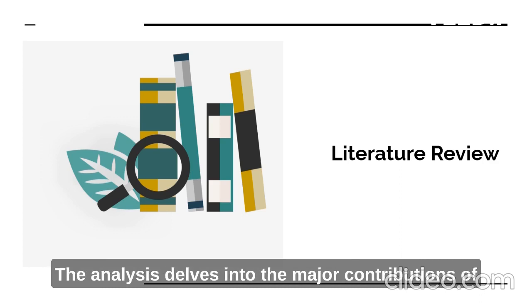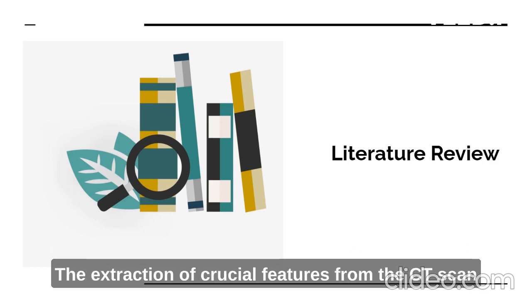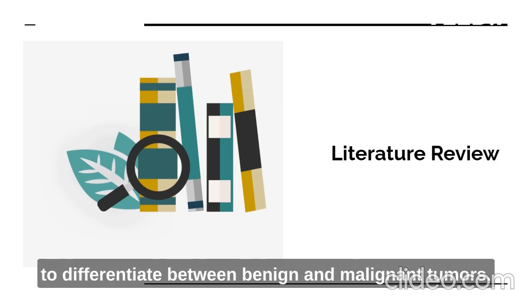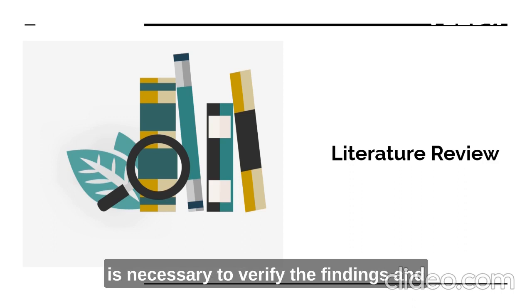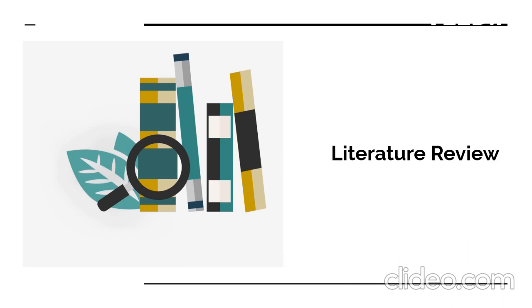The analysis delves into the major contributions of the proposed method, including the use of a database of lung images for CT scan image extraction, the extraction of crucial features from the CT scan images using deep neural networks, the utilization of a 3D CNN to improve diagnosis accuracy, and the ability to differentiate between benign and malignant tumors. Nevertheless, the paper mentions that additional research is necessary to verify the findings and overcome possible challenges, including obtaining sufficient high-quality training data and improving the comprehensibility of the DL models.